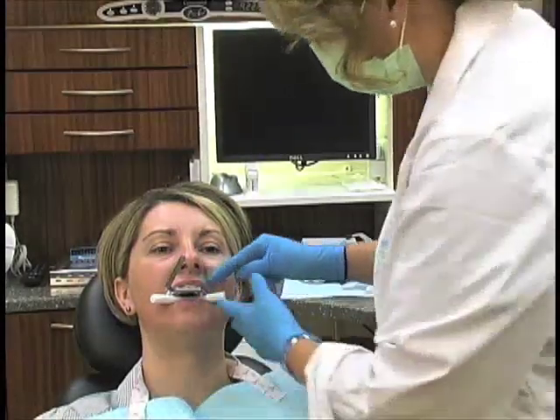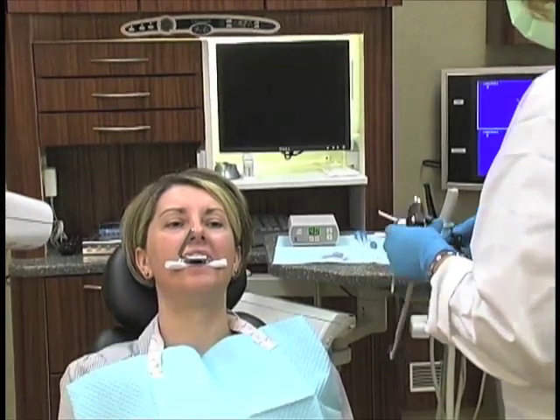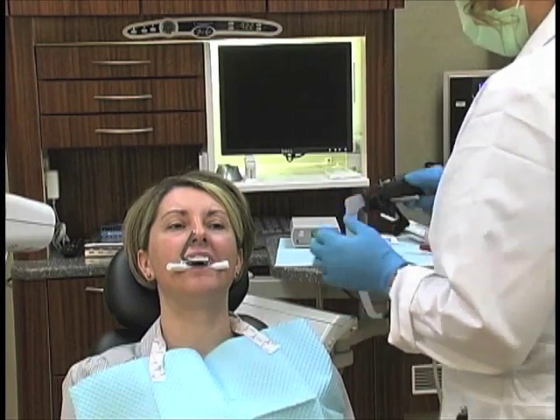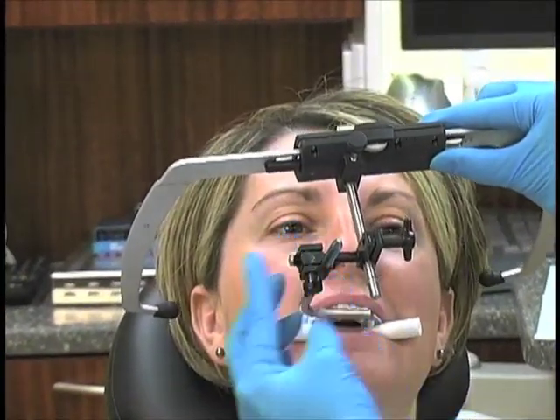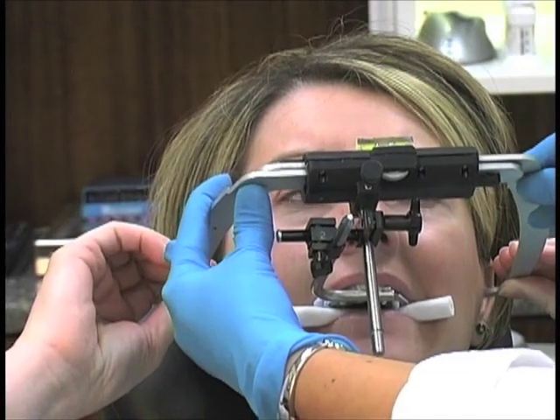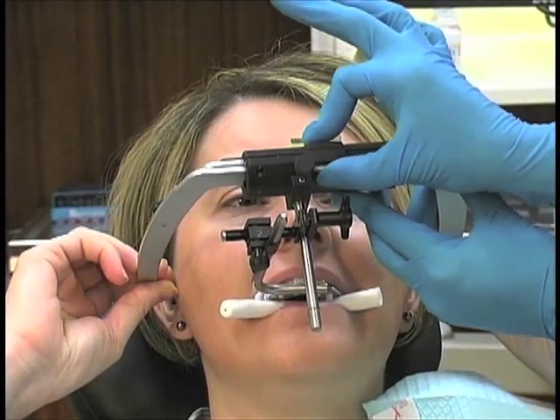Next, we get the ear bow. The ear bow has two components: the part that goes in the patient's ear, and the transfer jig. The transfer jig is the removable part you'll become familiar with when we start talking about mounting casts. We attach the face bow to the head — the transfer jig slides onto the bite fork — and we have the patient help guide the face bow into their ears. The face bow is now on their face, and the bite fork is attached to the maxillary arch.